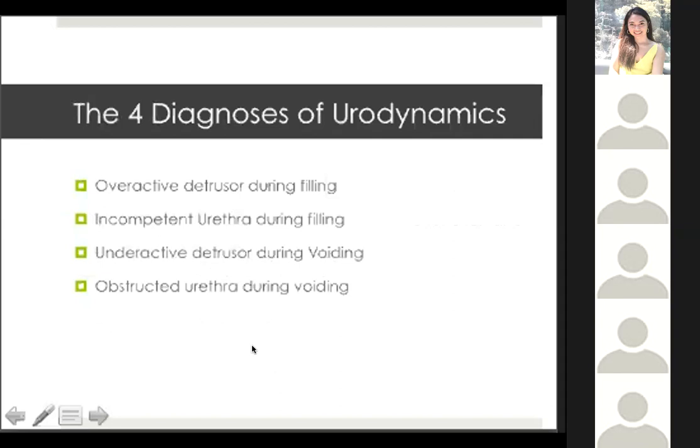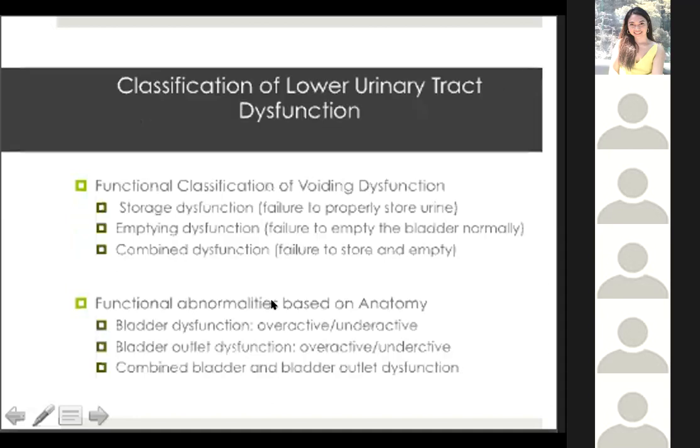So there are four diagnoses of urodynamics. First, we can diagnose if the bladder is overactive during filling, or an incompetent urethra during filling, if the patient has incontinence. Then underactive detrusor during voiding, so we will see if there is a residual. Then obstructed urethra during voiding.